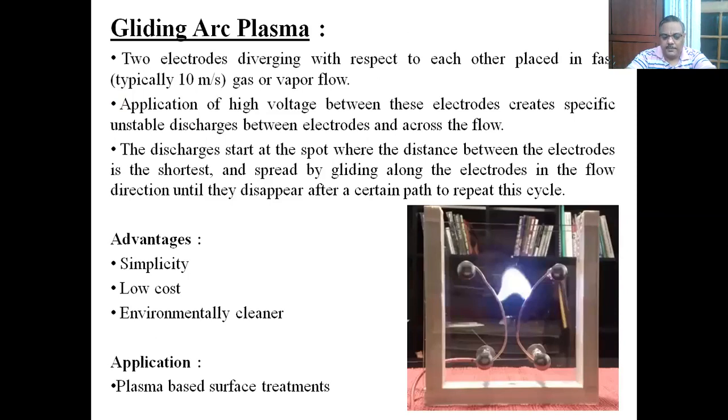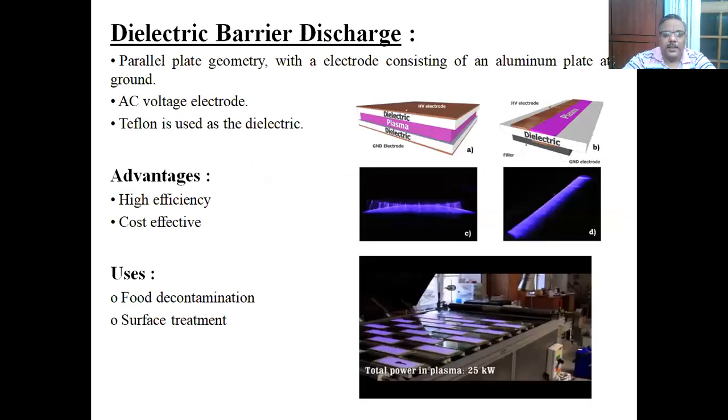The advantages are the simplicity, low cost, environmentally cleaner, and applications are based on plasma surface treatments. The next one is the dielectric barrier discharge.